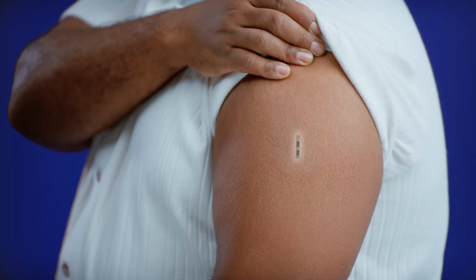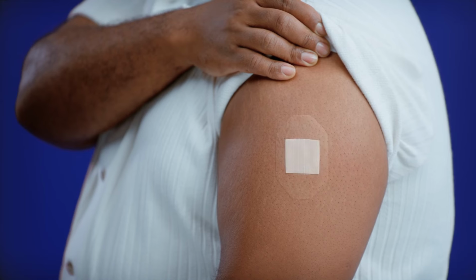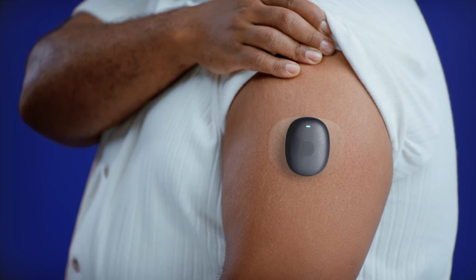The only thing that we do suggest that you carry with you is a very small sleeve of double-sided adhesive, because our transmitter is actually designed to come off every day, right? Because you can take it on and off. We suggest that you take it off and put a fresh, brand new adhesive on, so the biocompatibility of that adhesive is much, much better. Clean the area when you're in the shower, and then when you get back out, you put that brand new adhesive on.